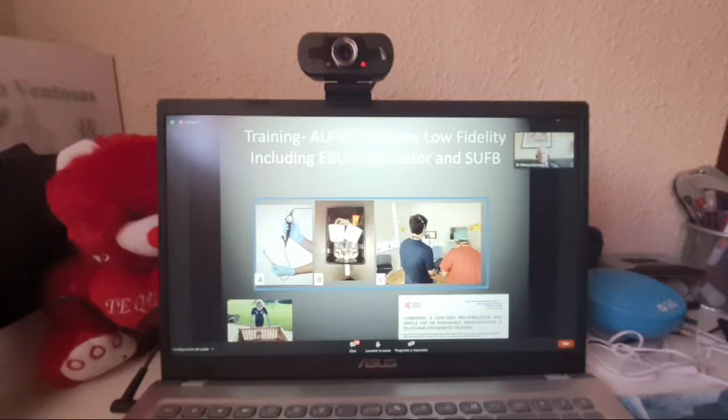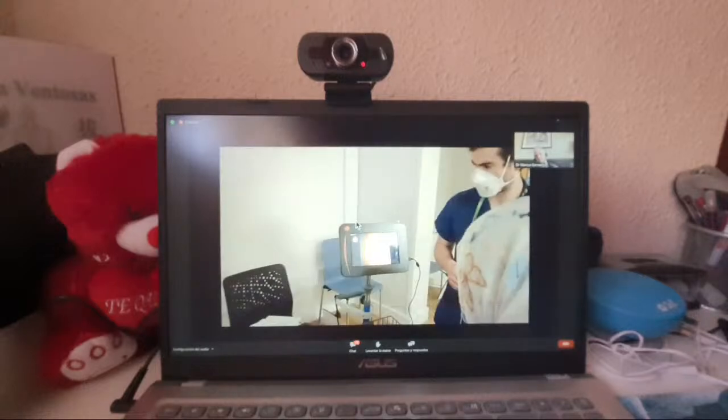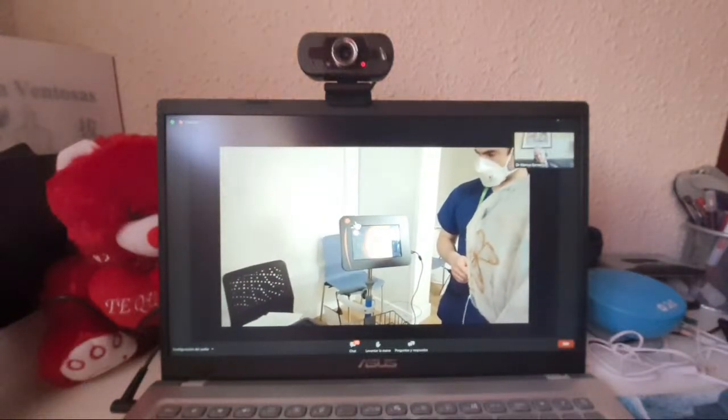So just finally, I have a picture of Ed Sheeran here, the singer. During lockdown, he made a crib for his child. During lockdown, I made a low fidelity simulator. You can see there's toilet paper here, which allows pliability, and Play-Doh. And we use this to train.